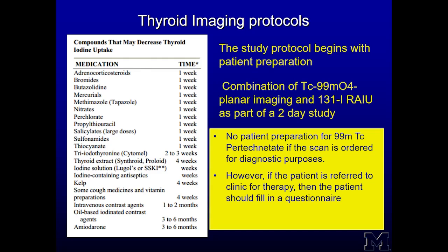So, thyroid imaging protocols. The study protocol always begins with patient preparation. So, being cognizant of the patient's clinical situation, laboratory tests, and also having knowledge about the medications that this patient is taking. For pure diagnostic imaging with technetium pertechnetate, there is no need for any special preparation. However, knowledge of the medications is very important for interpretation of the imaging.